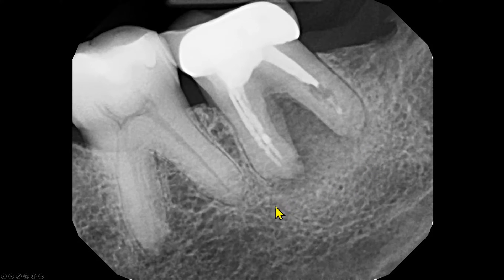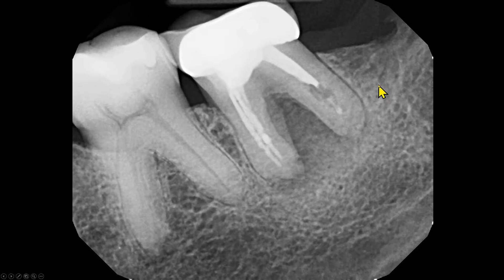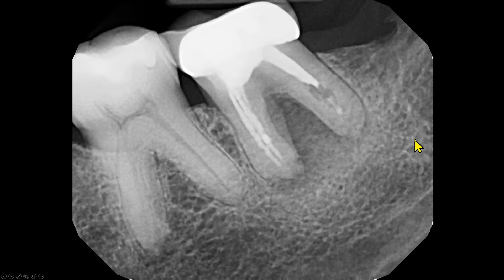Also, we do not see a distinct border of this radiopacity. It seems that the radiopacity ends here — maybe it ends here. We are having a difficulty, and this difficulty is one of the radiographic features. We are unable to define the border of the radiopacity.